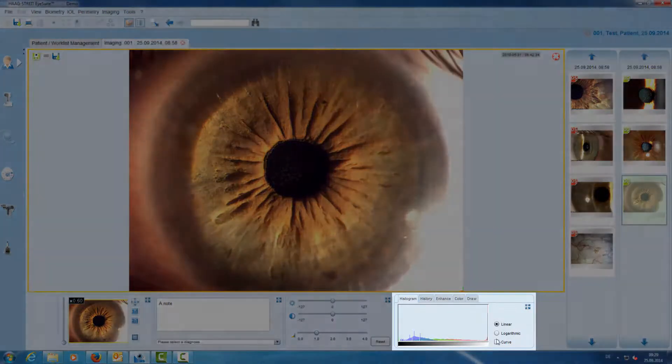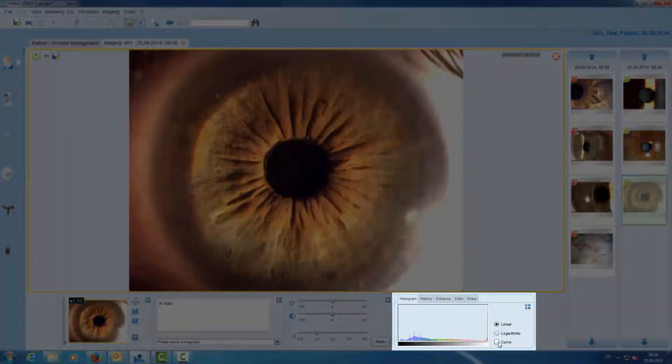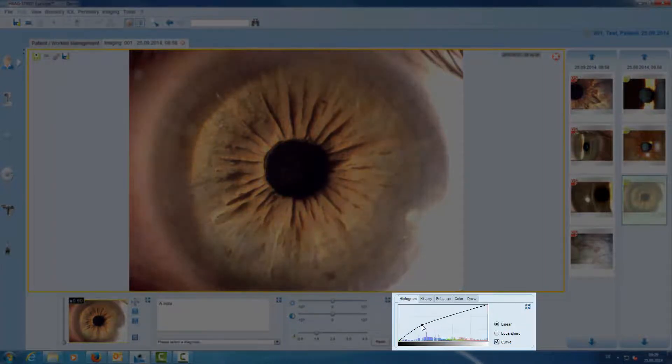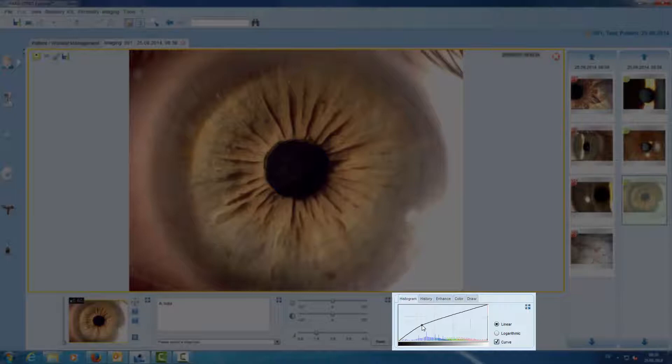In the histogram we have a curve tool which allows us to stretch or to compress the tones of the input image.